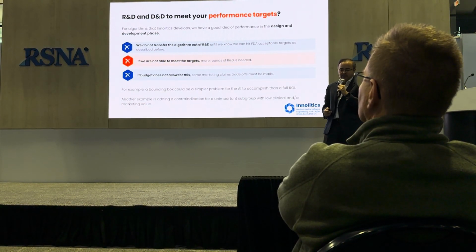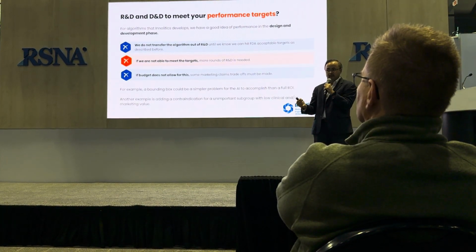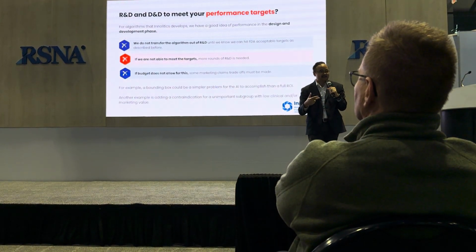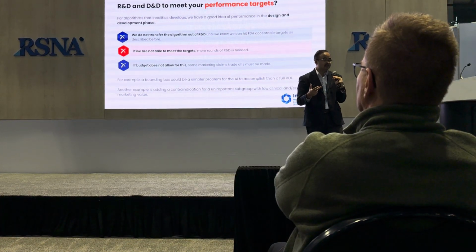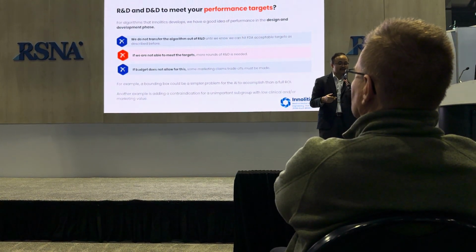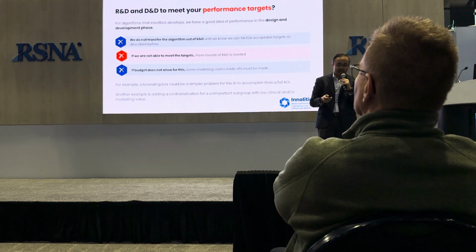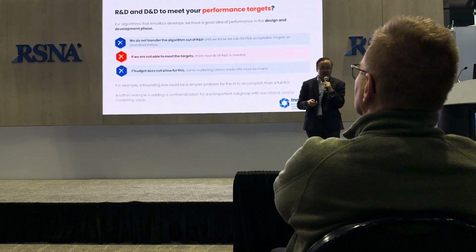One other common thing that happens: there could be a subgroup where your algorithm performs very poorly, but that subgroup is not really clinically meaningful. That subgroup is not meaningful from a business perspective either. So you can add in your labeling that your device doesn't support it, or it supports it with less accuracy, and give ground there so that you can save ground on some other topics that are needed.